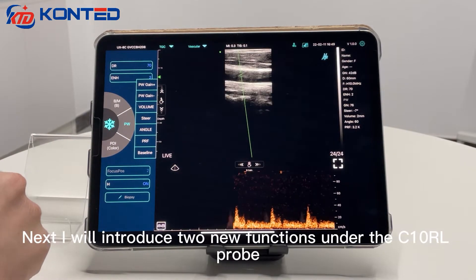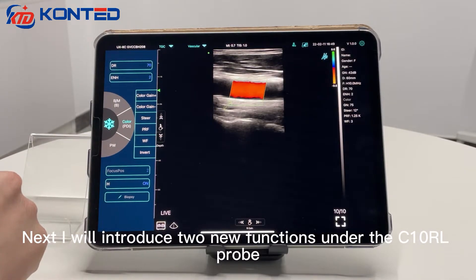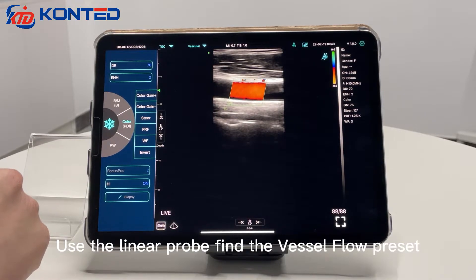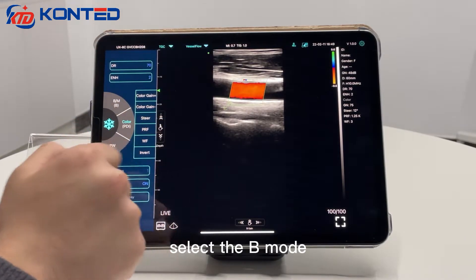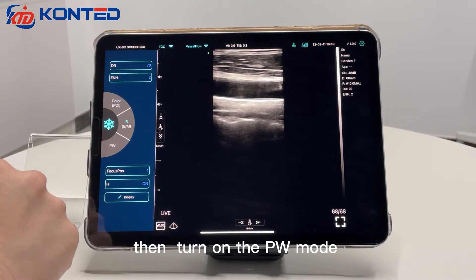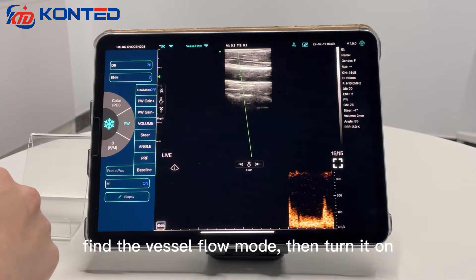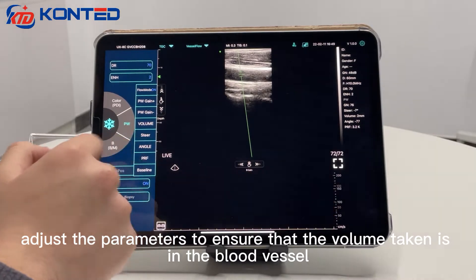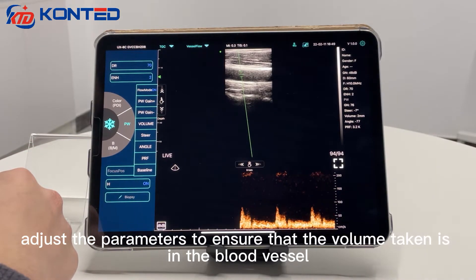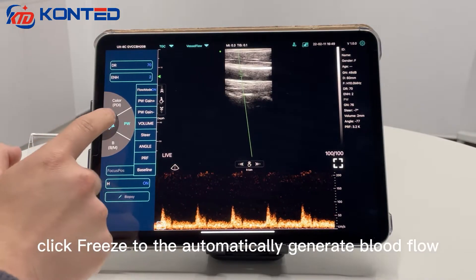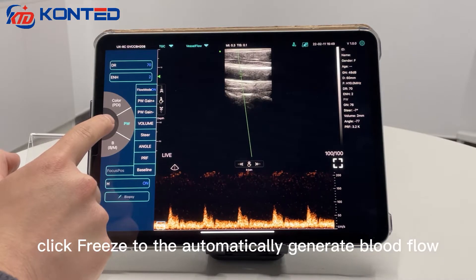Next, I will introduce two new functions under the C10RL Pro. First one: Auto Blood Volume measure function for the C10RL linear probe. Use the linear probe, find the vessel flow preset, select B mode, and find the current blood vessel. Then turn on PW mode, find the vessel flow mode, and turn it on. Adjust the parameters to ensure the sample volume is in the blood vessel. When the PW mode has a real waveform, click freeze to automatically generate blood flow measurement.